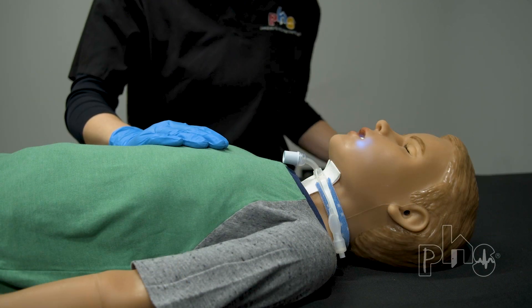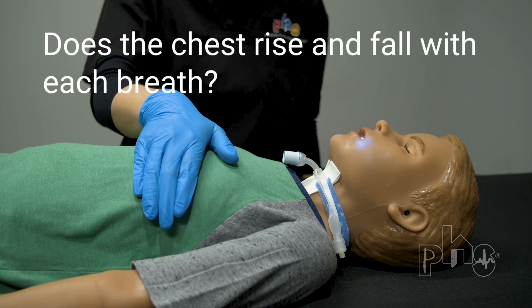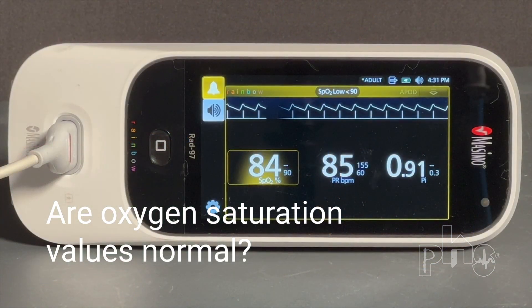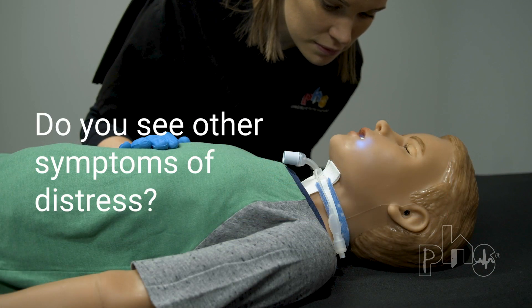After suctioning, assess the patient. Does the chest rise and fall with each breath? Is the patient's skin its normal color? Are oxygen saturation values normal? Do you see other symptoms of distress?